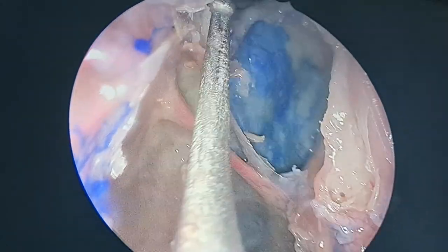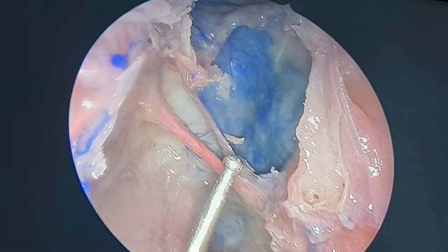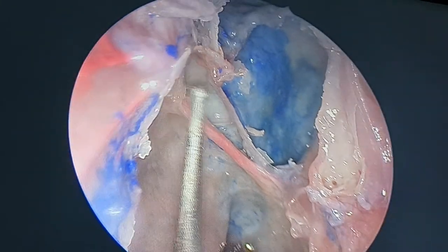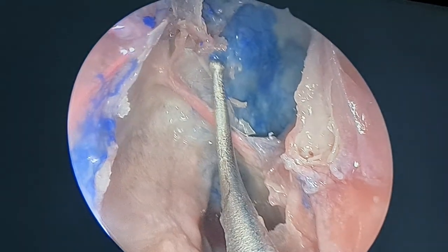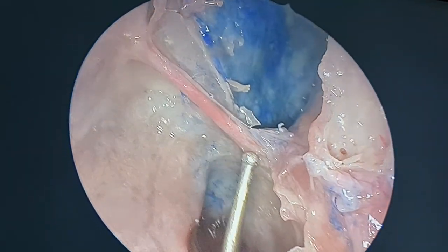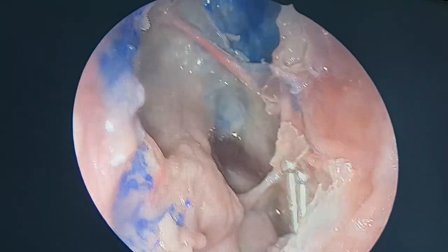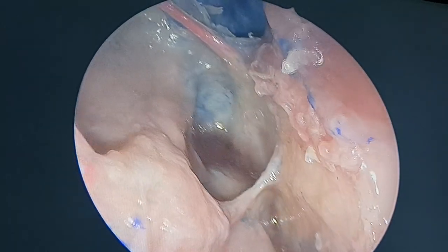Now see, again, above was the frontal, see that was the frontal. That is the supraorbital recess. Immediately caudal to the supraorbital recess is the artery. So again, not to forget, whenever you find a supraorbital cell, assume that the artery is immediately behind it. Okay? And now this is the bulla, the remnant I can remove. And this is the lamina papyracea all the way.